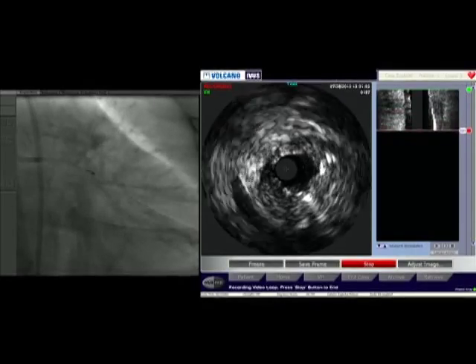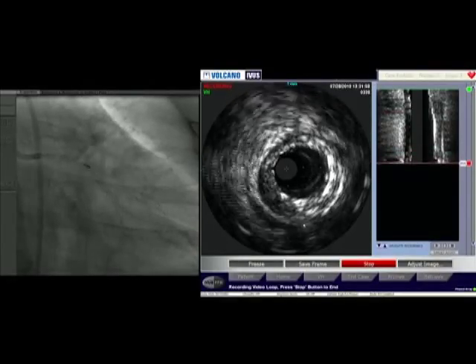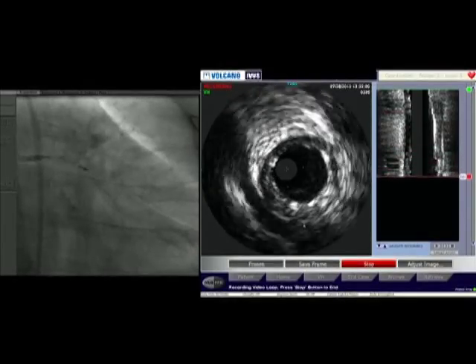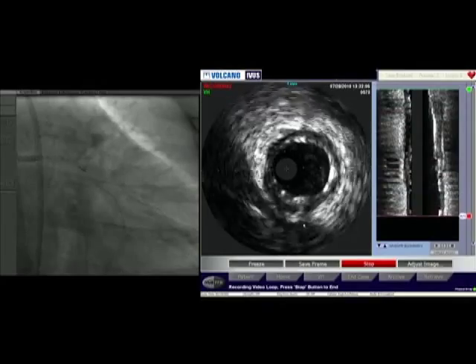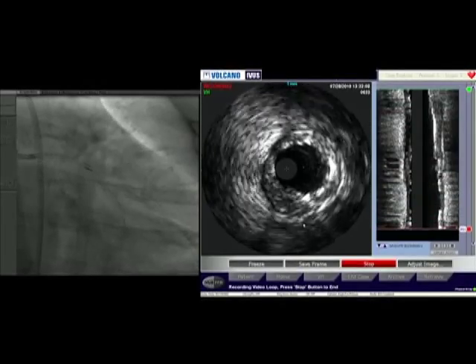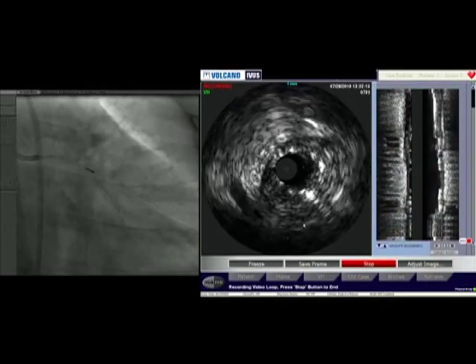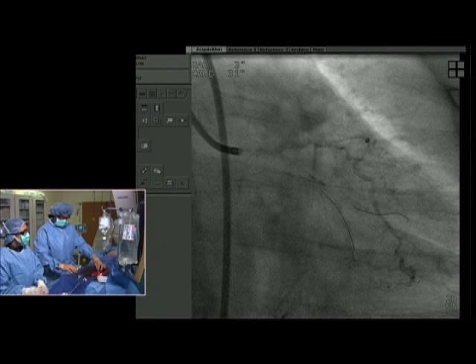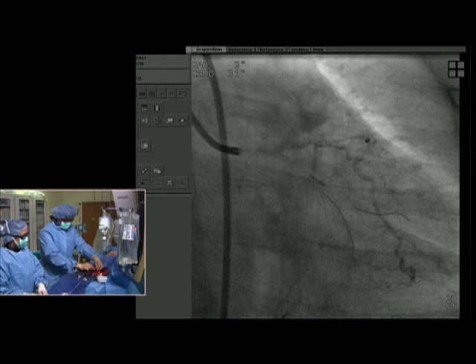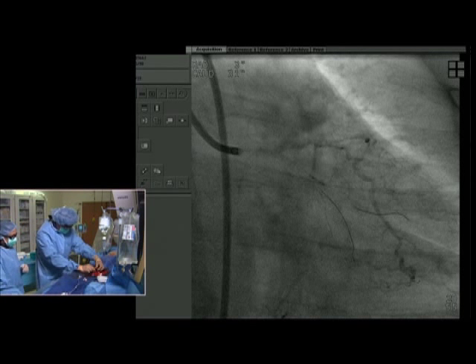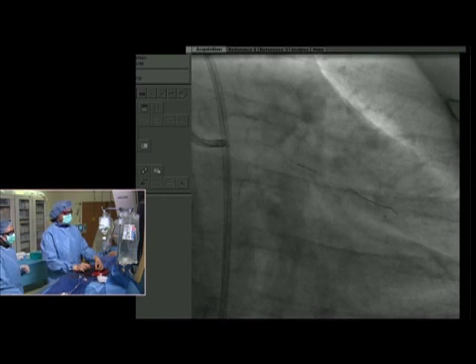The stent is still underexpanded in that area, so we'll make it a little bigger. Proximally, our balloon has actually expanded it pretty well — the proximal stent is completely expanded, which is very good. The distal vessel is small, so we'll put a 3.0 balloon in the middle and post-dilate. It looks pretty good — we're pretty close to done in this area. We'll pull the jail wire now — this is a moment of truth — and it comes out like butter, which is actually pretty good.